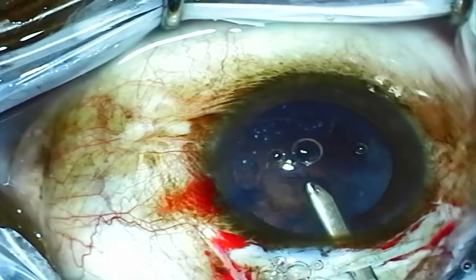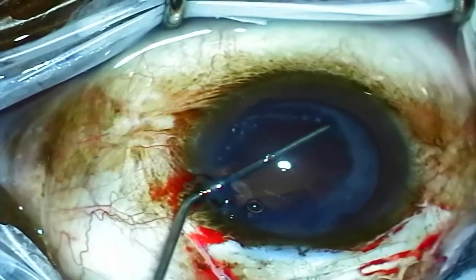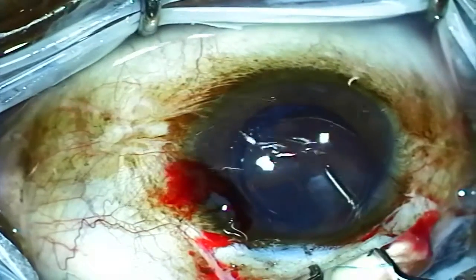The Simcoe cannula is then used to remove any remaining cortical material, and then the anterior chamber is reformed with viscoelastic.